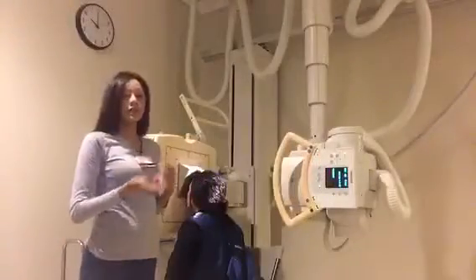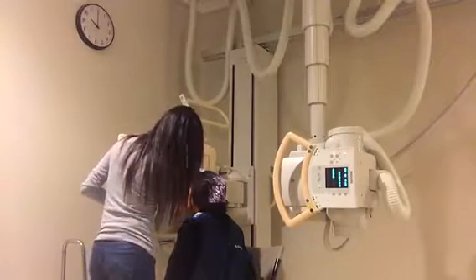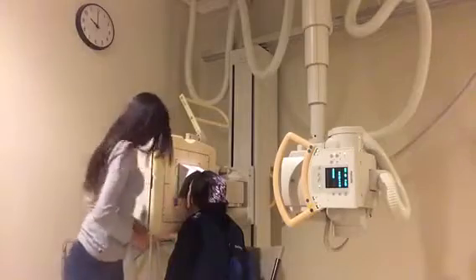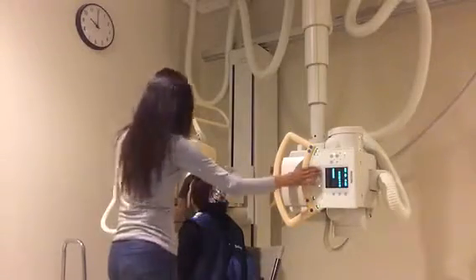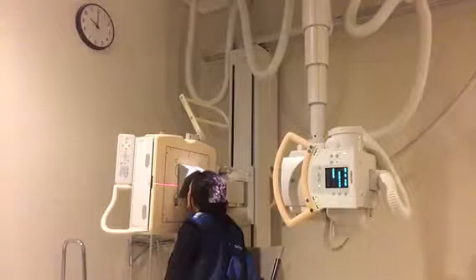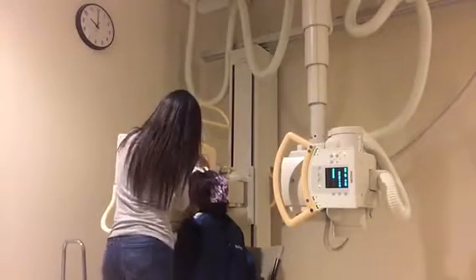So I'm going to be using my left marker indicating that it's the patient's left side. Okay. So go ahead and take a deep breath in and hold it, x-ray. Go ahead and take this.